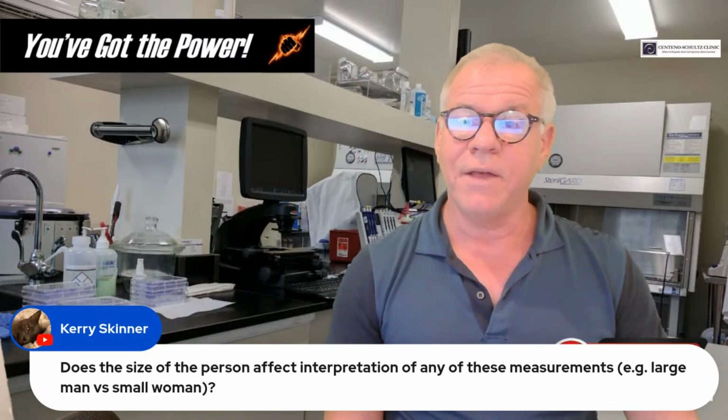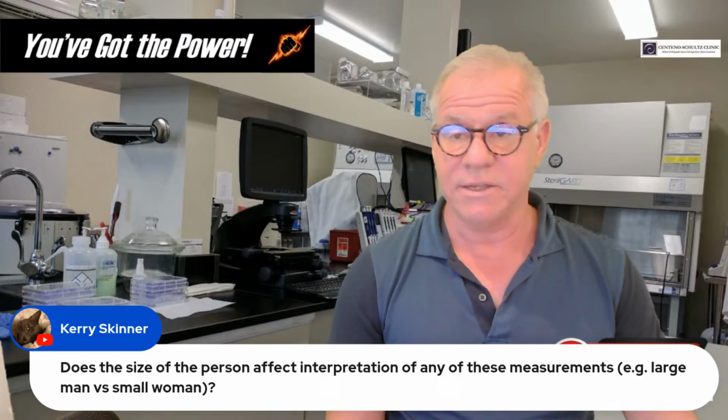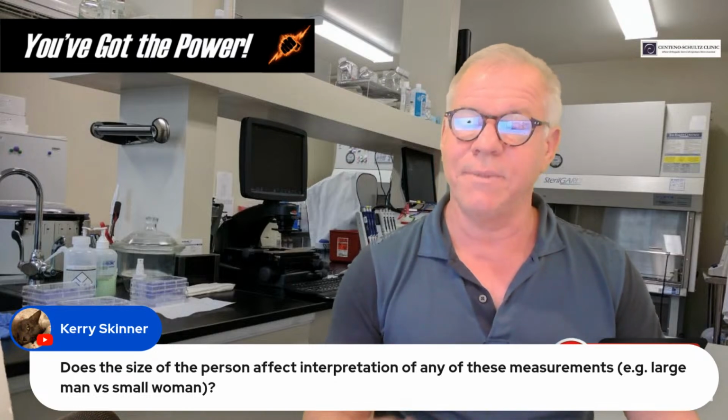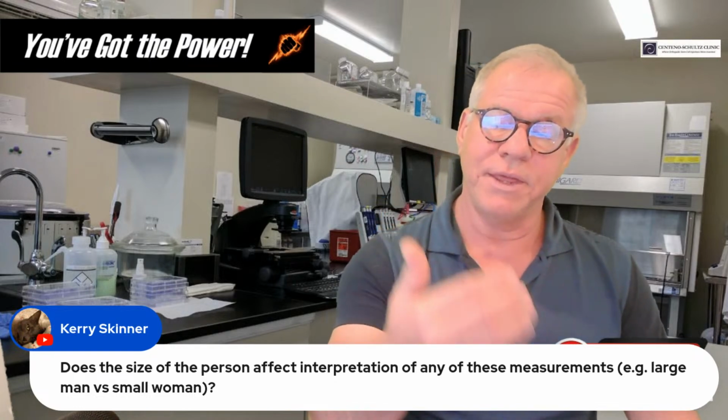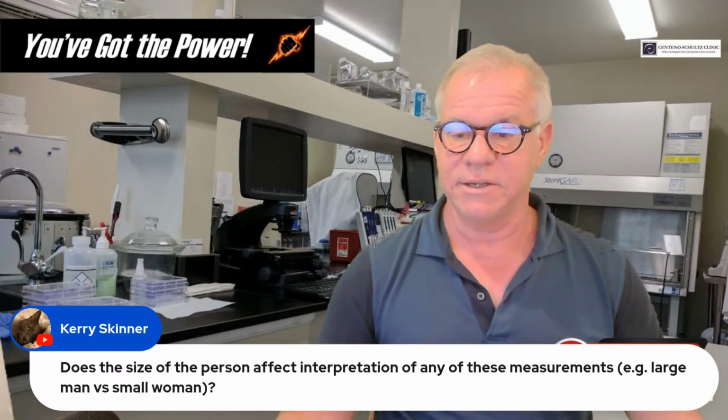But if we're talking about the difference between very large men and very small women, there is a sizable difference. So we always have to be careful to be a little bit flexible on some of these measurements and try to put them together with the clinical picture to see if it all makes sense.